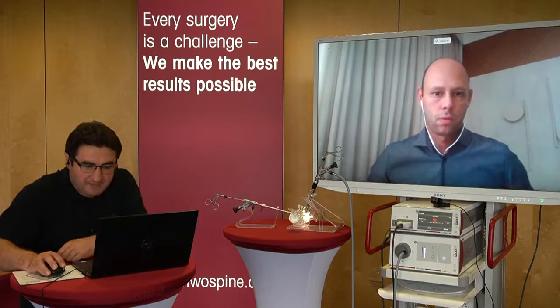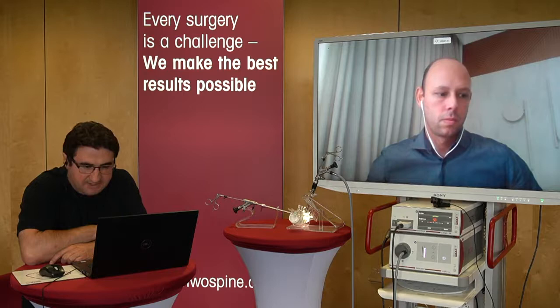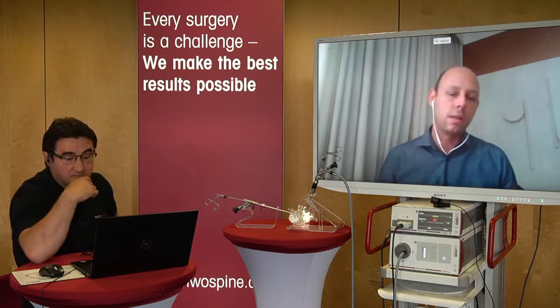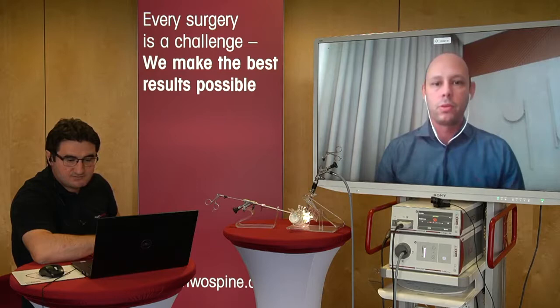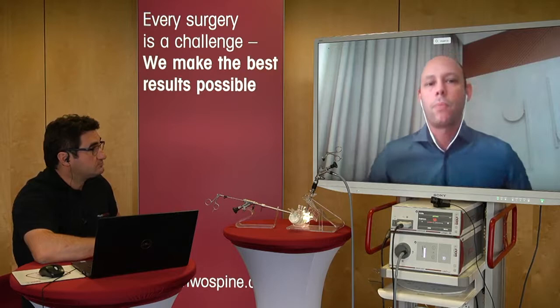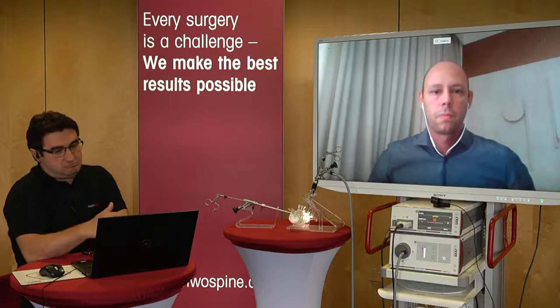Another question. In the second case, you chose to go directly transforaminal. Are you not scared to squeeze the exiting nerve in the foramen because the herniation was partially in the foramen? Is starting extraforaminal not safer? Very good questions. I saw my exams before the surgery, and this foramen was big. It's no problem to do this because I had a component in the canal and extra canal. But the extraforaminal approach is a good approach. I use the extraforaminal approach in most of my surgeries. It's so common, it's easier. No, my foramen is a big foramen, L4-L5 in this case. The patient was big. It's not a problem.